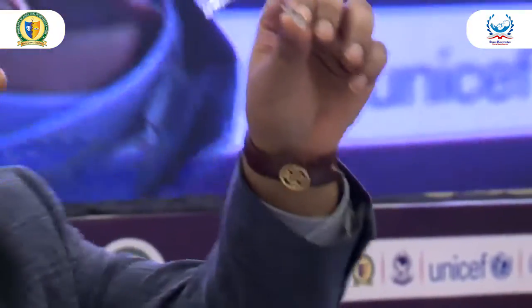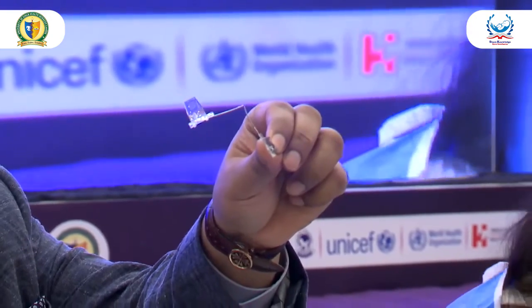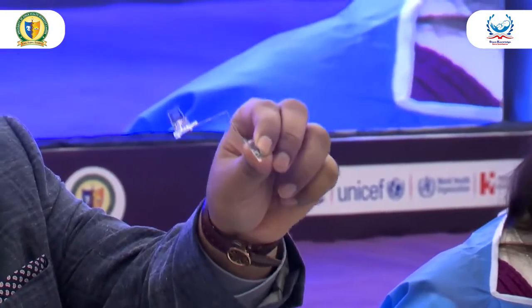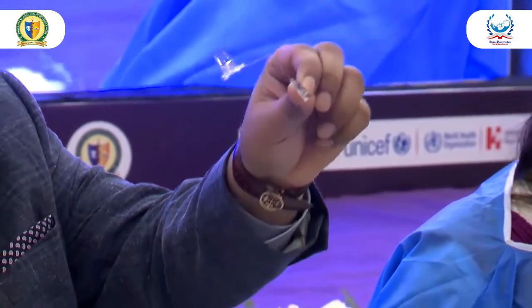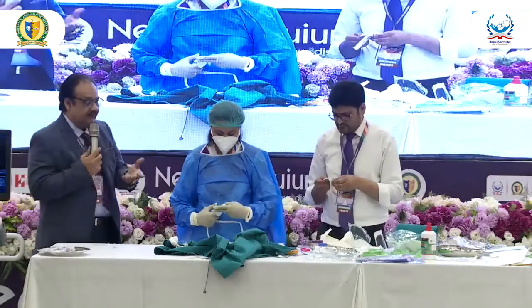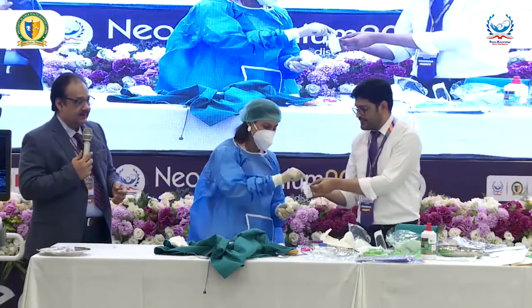Yeah, this is the breakaway needle. Either you can have this type of needle or the other type, which is the cannula, which you can break, which is plastic. Then after doing this, you have to cover this.